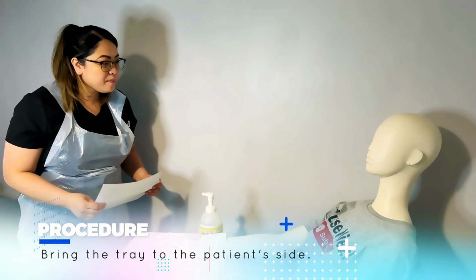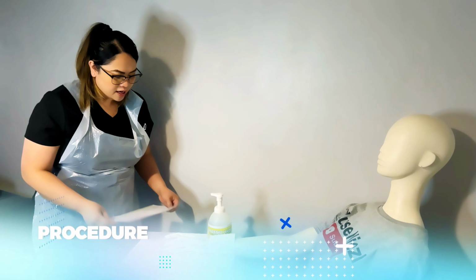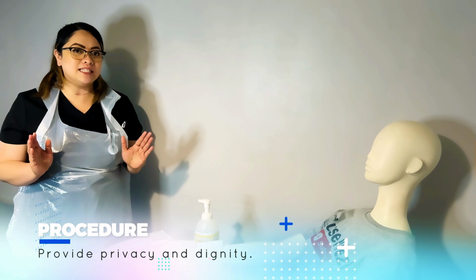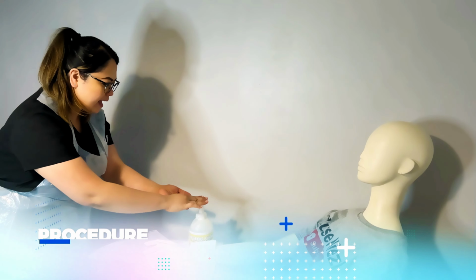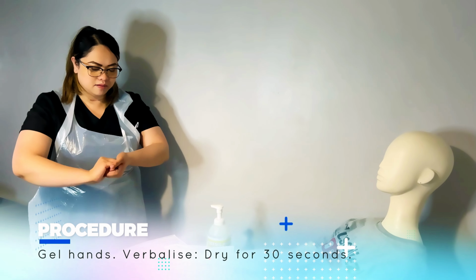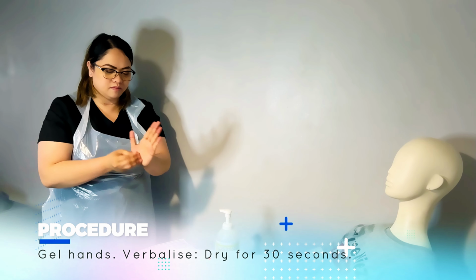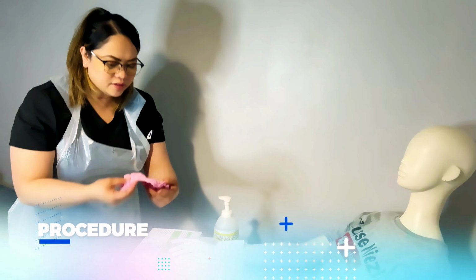Hi again, Lailene. I'm here now to give you your injection, if that's all right with you. Okay, so again, before I proceed, I'm gonna provide privacy and dignity to the patient, making sure that the windows or the curtains are closed or the door as well, okay? So let me just gel my hands and let it dry for 30 seconds. So let me just wear my gloves.